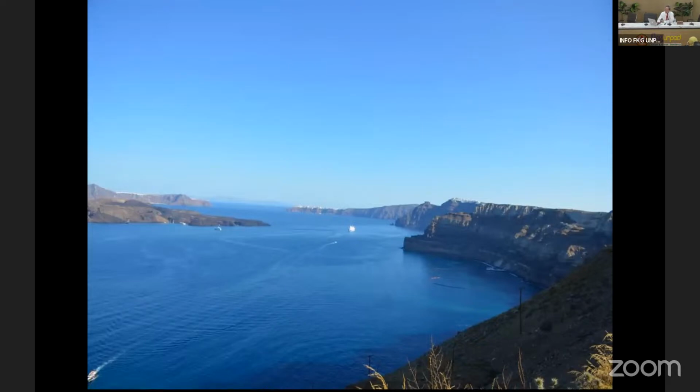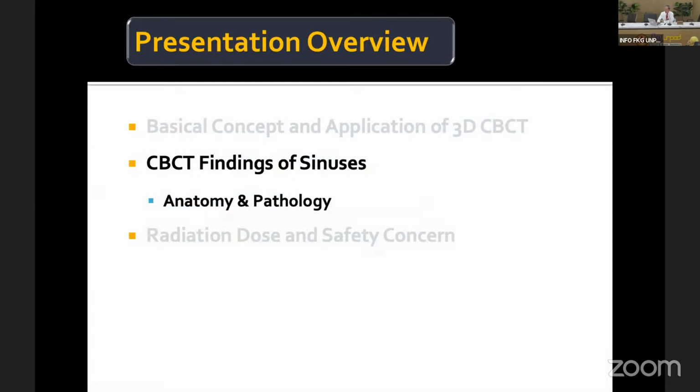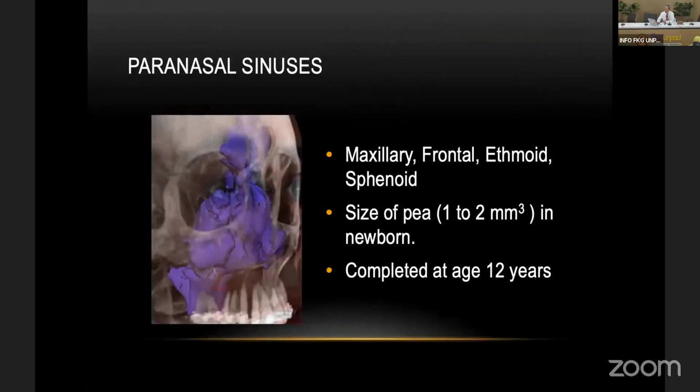Now for the sinuses, because when we do the cone beam, a lot of the time we're looking at the sinuses. For maxillary implants, we often need to do a sinus lift as well. As we know, we have four paranasal sinuses: maxillary, frontal, ethmoid, and sphenoid.